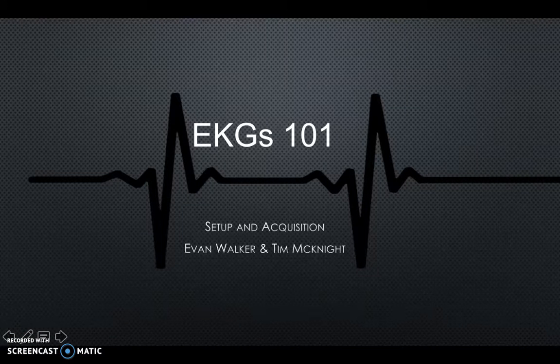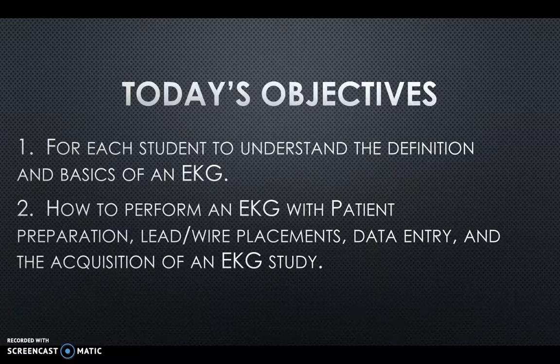Good morning. Today's lesson is EKGs 101, the setup and acquisition. I'm Evan Walker, and contributing today is Tim McKnight.